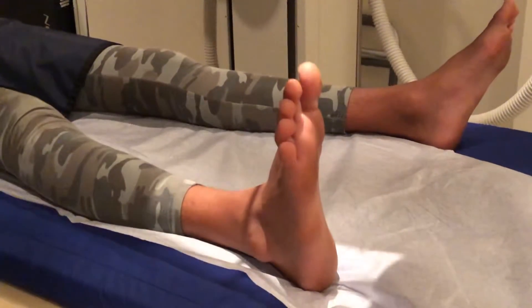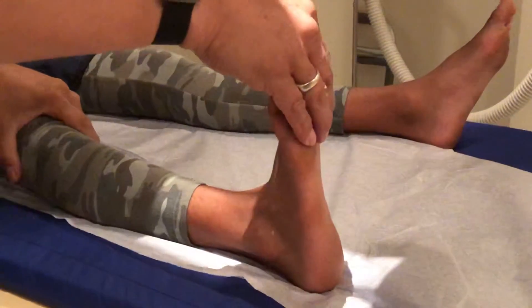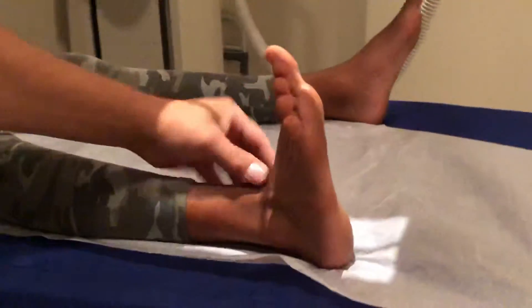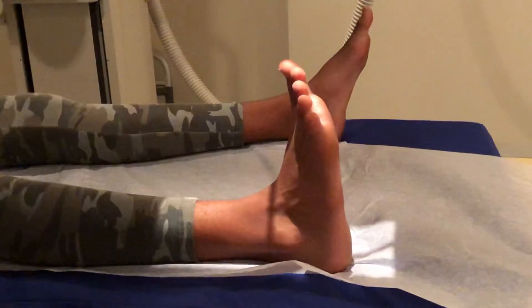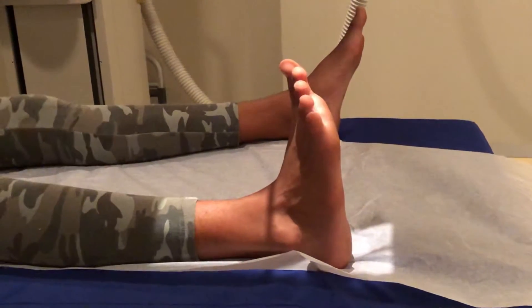The first one is going to be the AP view. What you're going to do is have the patient flex their foot back as best they can. You're going to center the central ray right here, where the foot and the ankle meet the lower leg — that junction — and that'll be the first x-ray. Right there.